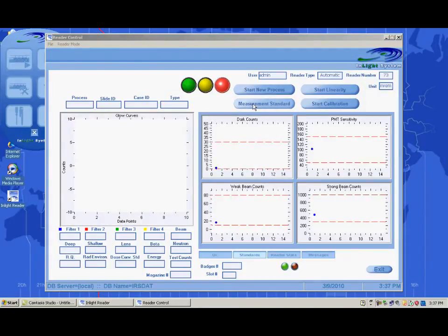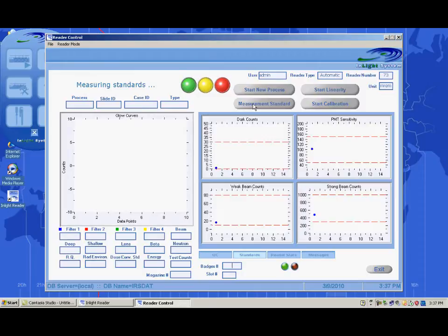The standard measurement tests can be manually initiated by clicking the Measure Standards button on the reader screen. It is recommended that you run 5 to 10 standard measurement tests each day before operation.